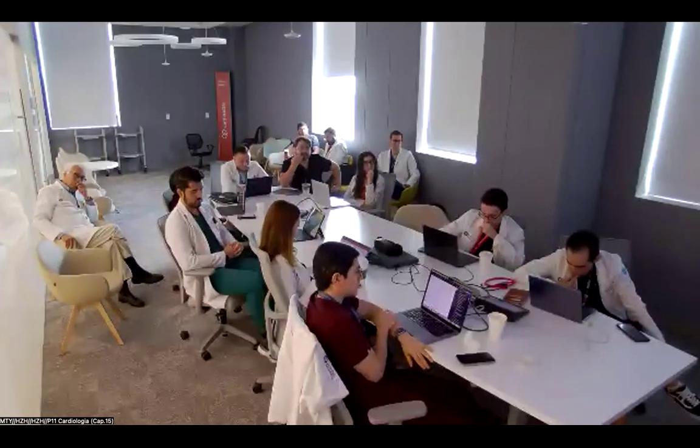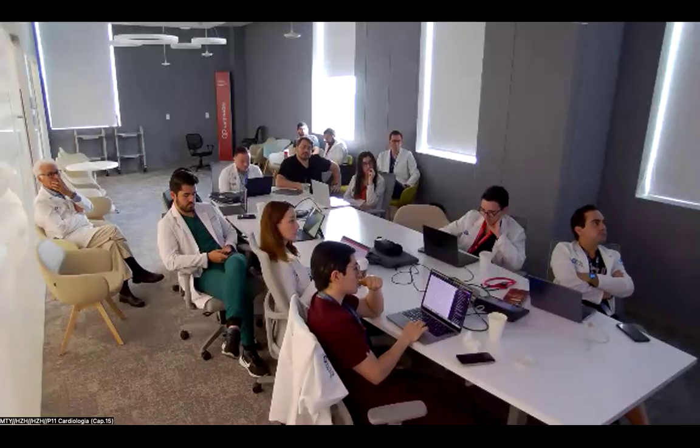We even have images from MR scan that show that the wall shear stress in these patients is actually less good. So even after TAVI, we see that the highest velocity of the flow going into the aorta still touches the aorta, doesn't go nicely central in the aorta, but goes sideways on the aortic wall, and these aortas keep on growing. So what does it mean? That means if you do a TAVI in a bicuspid patient with a dilated aorta, you have to try to implant your prosthesis as central as possible.